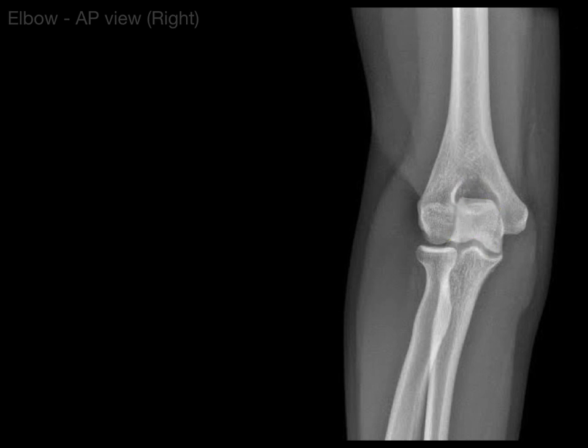Then you also have the trochlea — the pulley — where the trochlear notch of the ulna articulates. That's part of the hinge joint of the elbow. This structure that looks like the top of a head, anatomists called it the capitulum, which means 'the head.' It looks like a bald head from the top. That's what articulates with the head of the radius to make the pivot joint. There is the coronoid process, that anterior process that goes into the coronoid fossa.